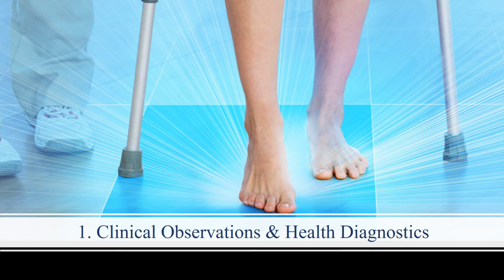The major points of observation are steps per minute, pain, stride properties, step behavior, swing characteristics, stance time, distance traveled, gait phases, GRF, arm movement, shoulder motions, trunk movement, pelvic movements, hip motions, knee motions, ankle motions, foot actions, base movements, joint angles, muscle force, momentum, and COP/COM profile.